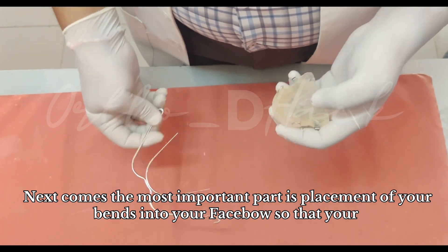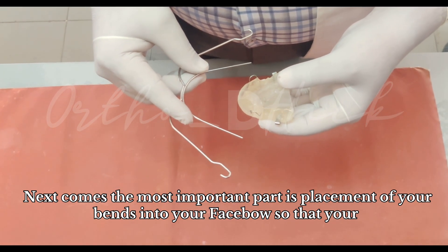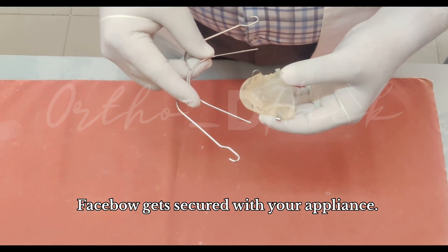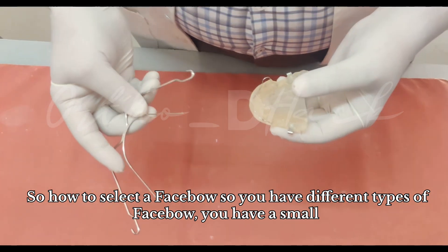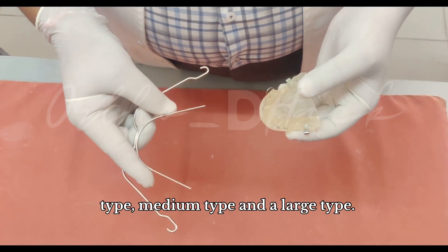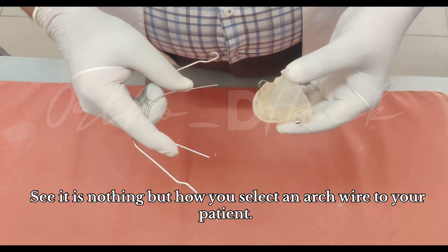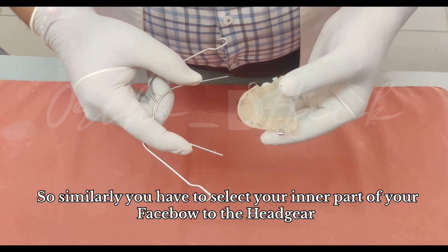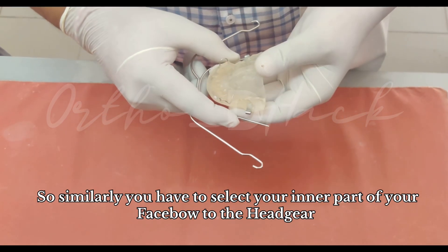Next comes the most important part: placement of your bends into your face bow so that your face bow gets secured with your appliance. To select a face bow, there are different types — small, medium, and large. It's similar to how you select an arch for your patient, and similarly you have to select the inner part of your face bow to the appliance.